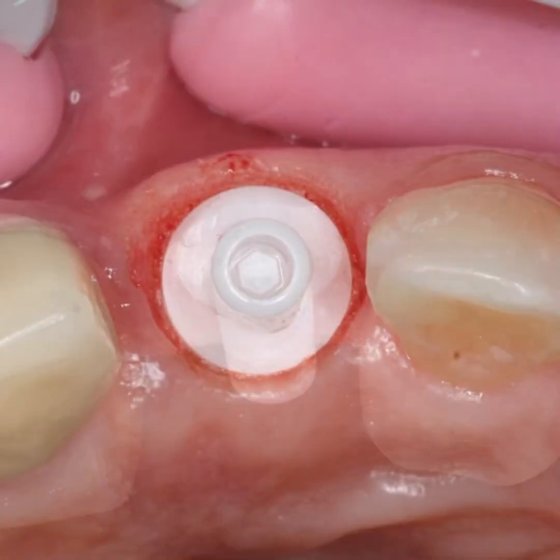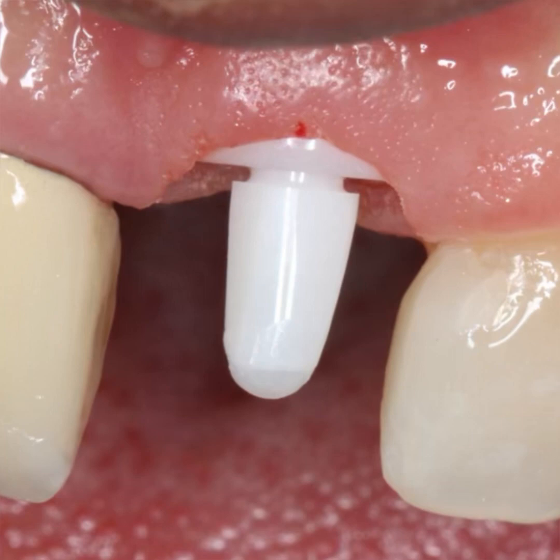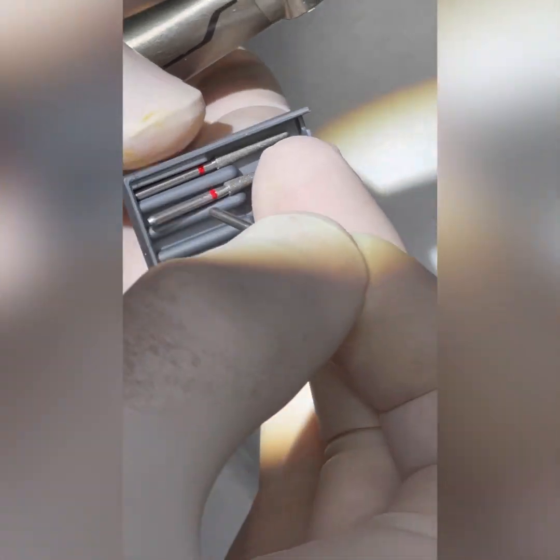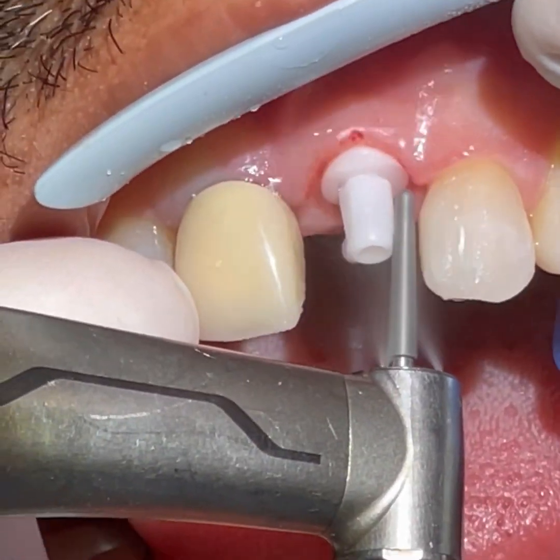I personally don't let it break — I stop when it starts bending. Now we notice here that there is a gap between the abutment and the platform of the implant. This is absolutely normal because it is a conical engagement which should have the freedom to sink deep into the chamber without hitting the platform.